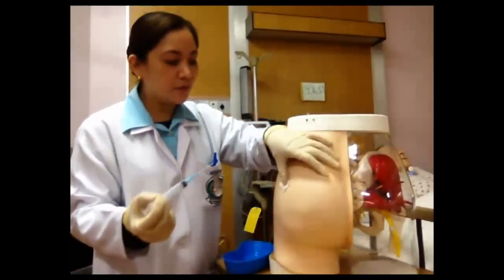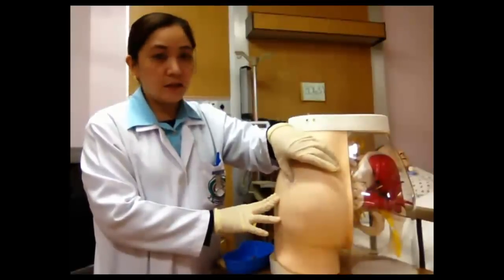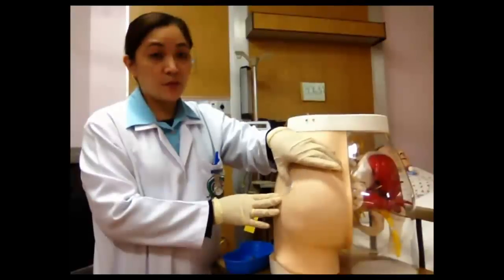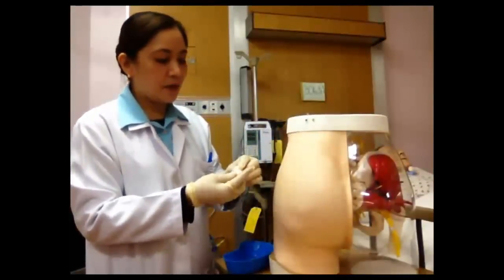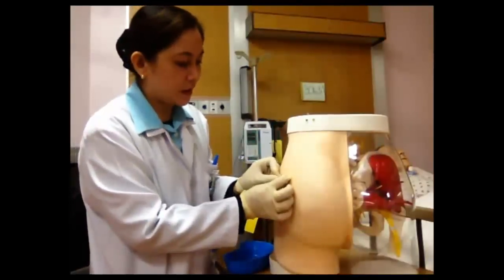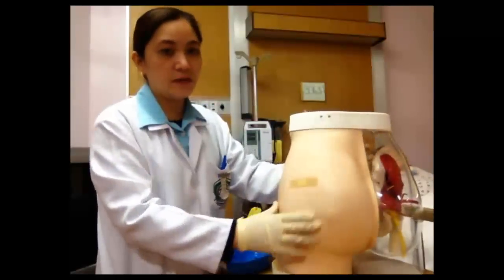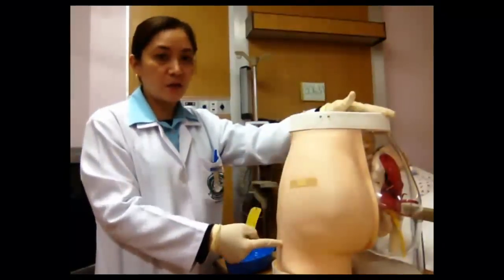Then quickly remove and gently massage the gluteal muscle of your patient for better absorption of the medication, and then place the band-aid that you prepared on the injection site. Okay, so this is how to inject intramuscularly into the gluteal muscle of the patient.